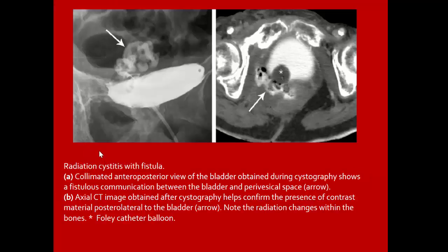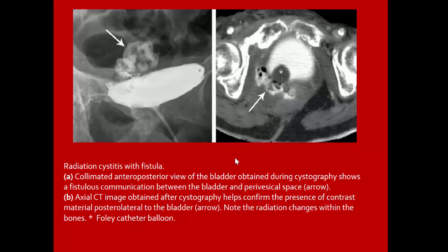Radiation cystitis with fistula: image obtained during cystography shows fistulous communication between the bladder and the perivesical space. Axial CT confirms the presence of contrast material posterolateral to the bladder with no radiation changes within the bone.